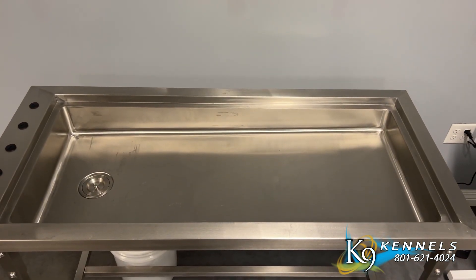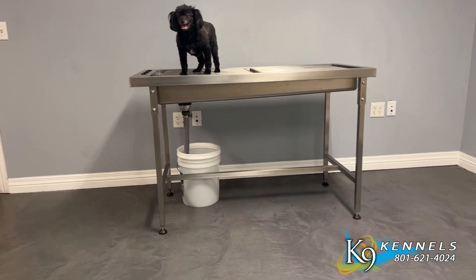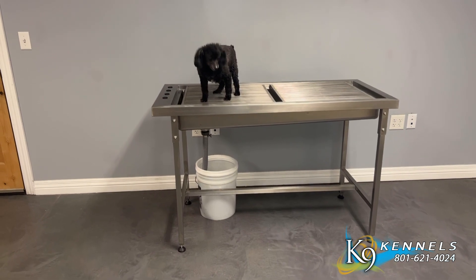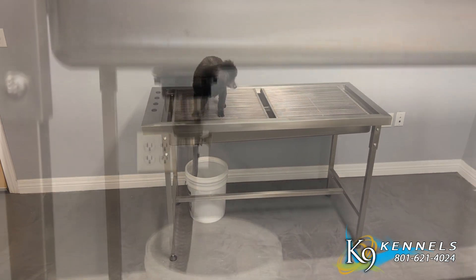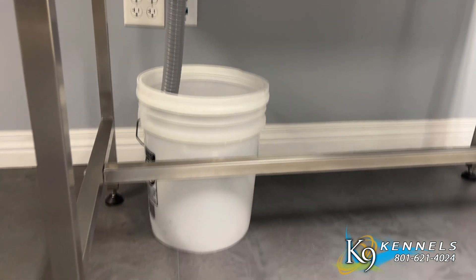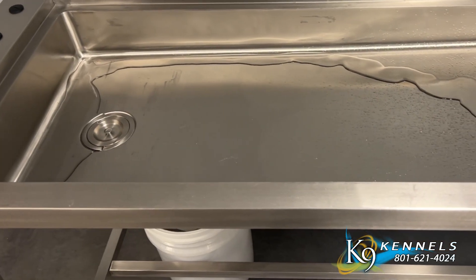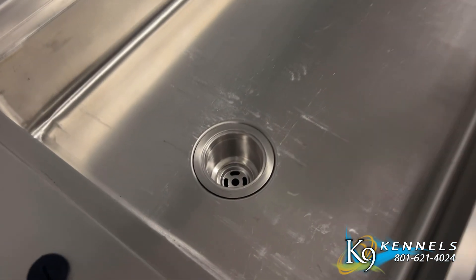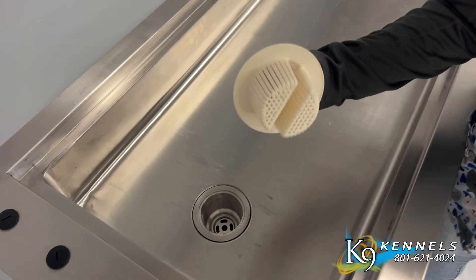The tub pan has a 4-inch depth on one end and a 6-inch depth on the other, with a 2-inch slope drop designed to facilitate efficient drainage of waste liquids. You can choose to drain into a bucket or directly attach it to your plumbing system, depending on your preference and setup. The table is equipped with a drain strainer that effectively prevents hair and debris from clogging the drain, making it easy to maintain and clean.